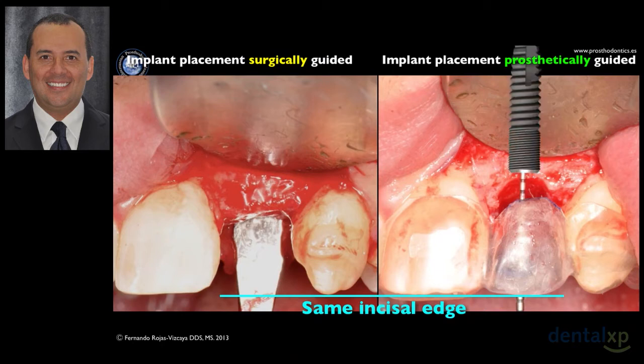But you can see here, I place the implant on one side according to the margin of the crown that I designed, 3A. And in the process to place the implant 3A or 3 mm apical, I need to reduce bone here. But on the other side, I don't use any template. I just place the implant where I have bone.